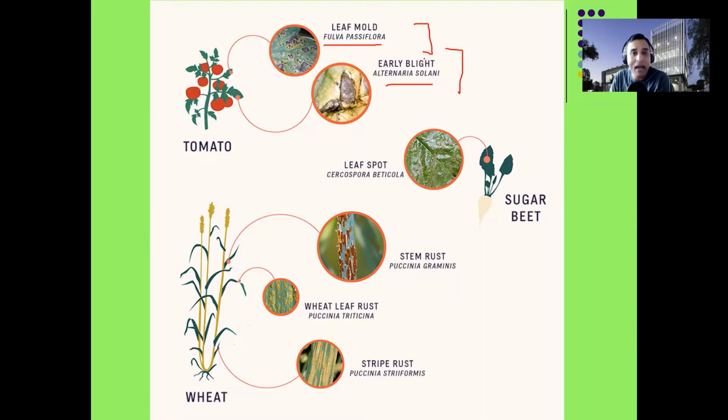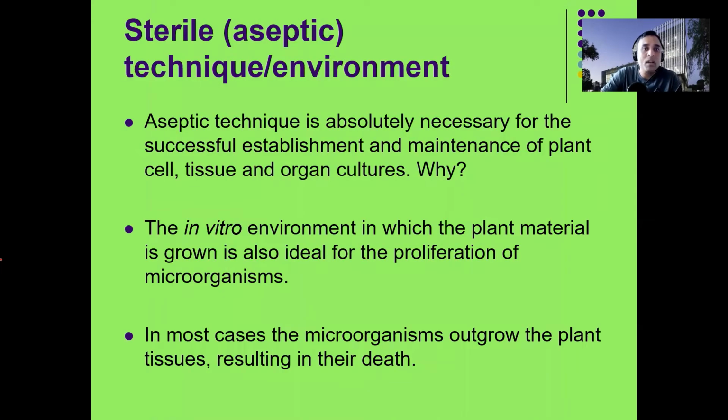But even a simple E. coli, even a simple other kind of pathogen that is just there to eat the media, okay, that is also not wanted, because by eating the media, they will spread all over the plant, and at the end, they will eat your plant. If they don't eat your plant, basically they will cover your plant and you cannot do anything, because whatever you do, it will replicate more bacteria or microorganisms than your own plant. Okay. So that is the important fact.